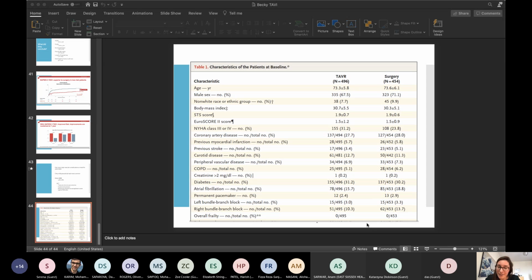And I think if you're in the position where it is a larger territory and they have significant deficit and high NIHSS score, it would be an urgent conversation with the TAVI operator. Because often what you'll find is that the procedure note is pretty brief. And when you actually have a conversation with them about how did the procedure go and what would the risk of bleeding for this patient be like, you'll find a whole lot more out by having a conversation with the operator than by reading their procedure notes.